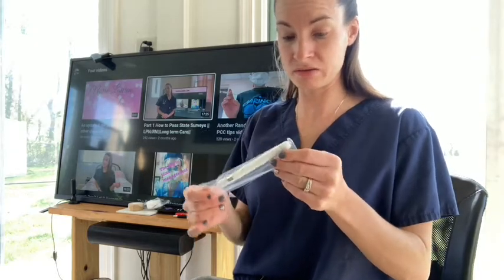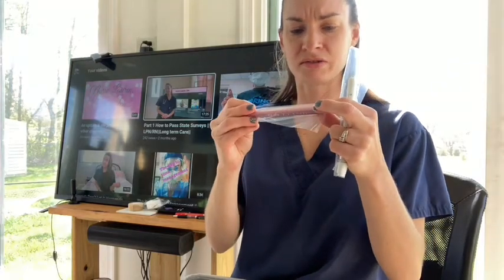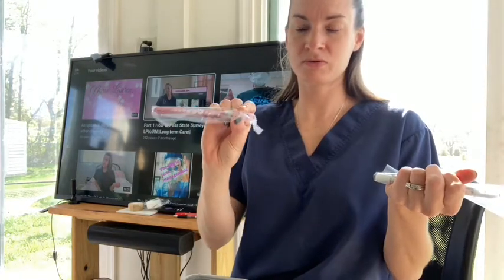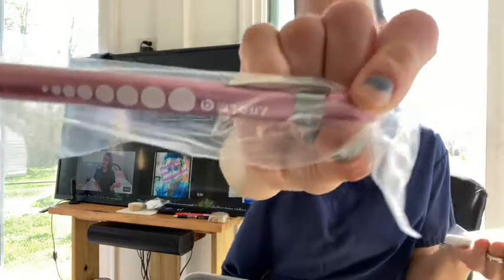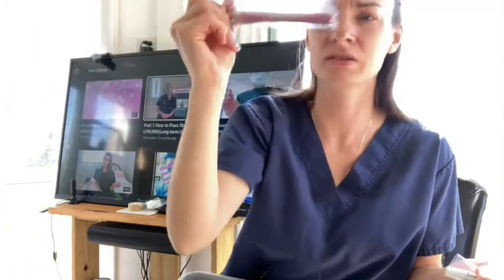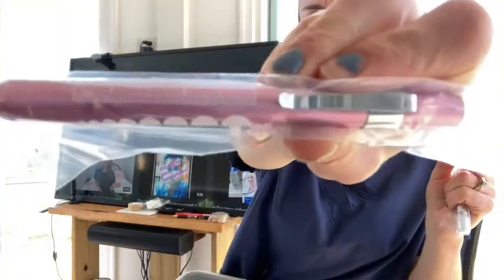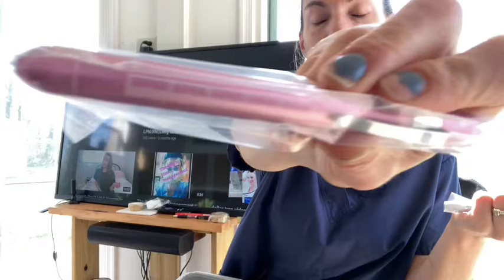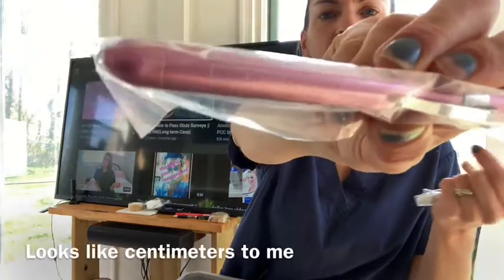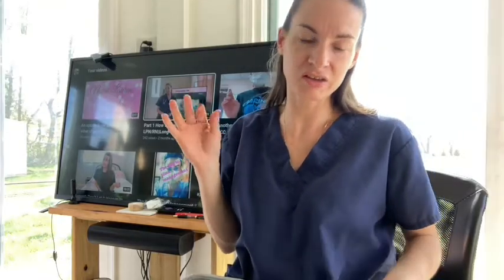It comes with pin lights, a ruler — though it doesn't say the units — and a pupil gauge. The ruler is on it right there but it doesn't say millimeters or centimeters. I definitely needed a pen light because I only had this keychain thing that had a light on it, so it comes with two of these.